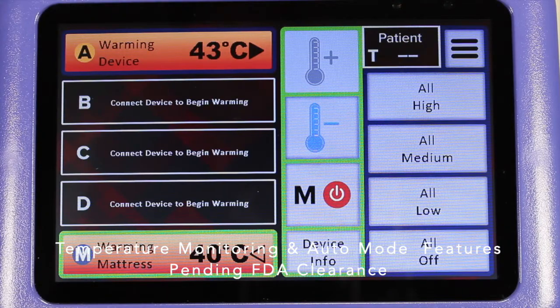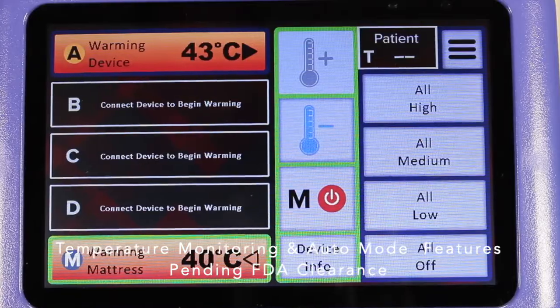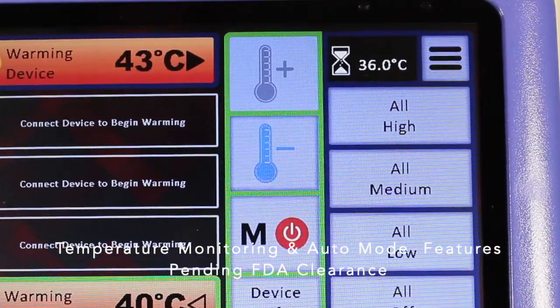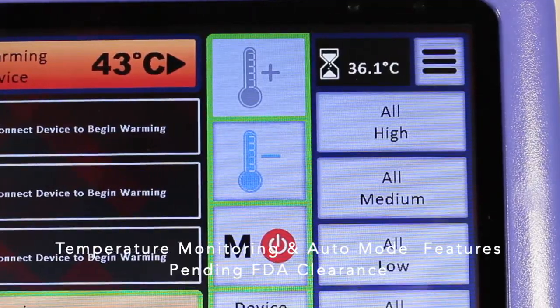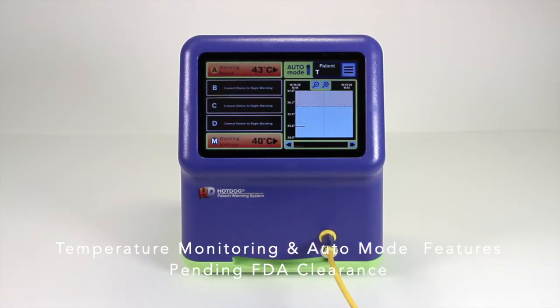If a temperature probe is connected but not yet in range to allow auto mode to function, the controller will display the temperature at the top of the screen next to the image of an hourglass. When auto mode is engaged, the patient's core temperature is shown at the top of the screen next to the letter T, as well as graphically displayed.